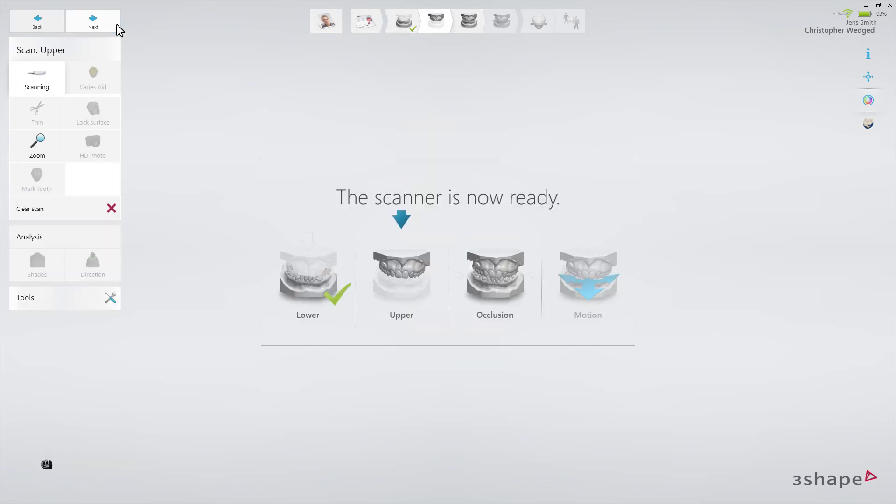Now proceed to the upper arch. Scan the same area as in the lower arch.